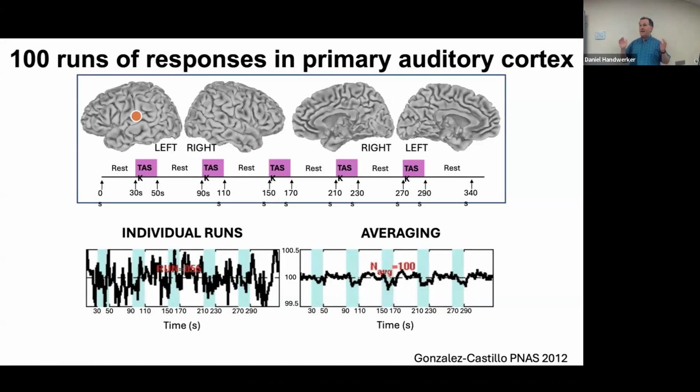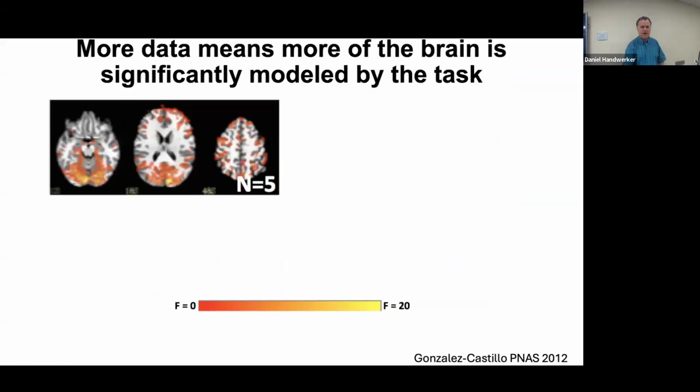So in the same task, in the same data set, there's one area of the brain where we have a very high contrast to noise, and another area of the brain where we are seeing a significant effect with a much lower contrast to noise. As you're planning and thinking about studies, it's not a universal measure. It's about what your expected effect size is in different areas and how much data you need to get it. Very often, especially for task fMRI, we talk about the areas of activation, but as you see, if you get enough data, it changes.